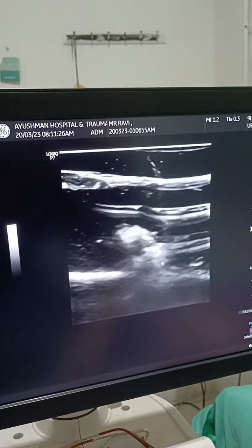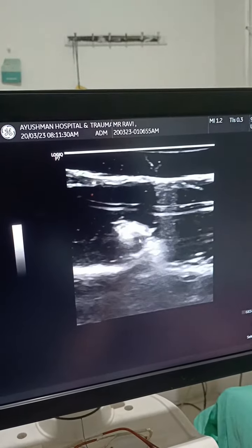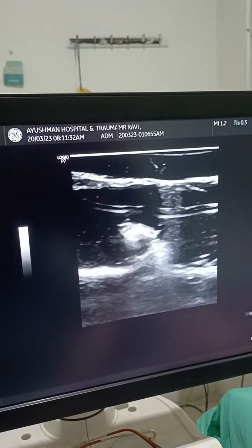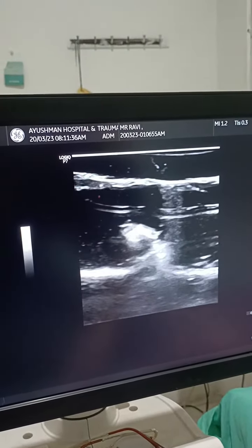Now we can see this is like our subclavian artery — a rounded structure. And this will be our first rib, that's what we will assume. And this will be pleura.